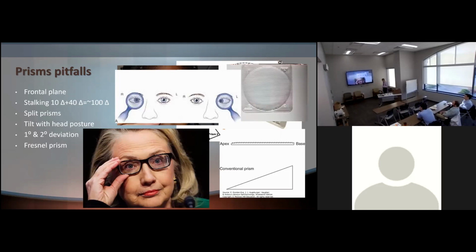You can tell the base and direction of the prism from the prismatic effect of the temple here, right? So she seems to have esotropia, and you can see the serration of the lens, and you can see the displacement of her temples through the glasses. And this is the way that you can tell the direction of the prismatic effect in any case.